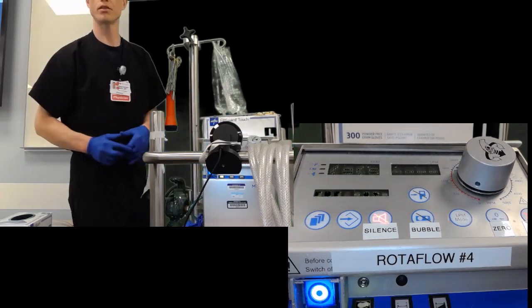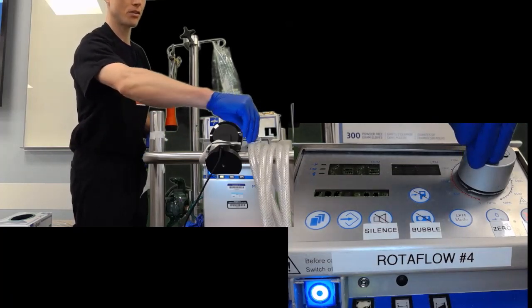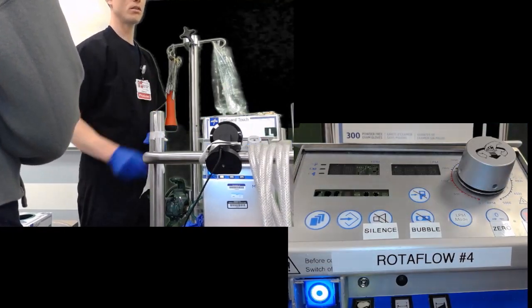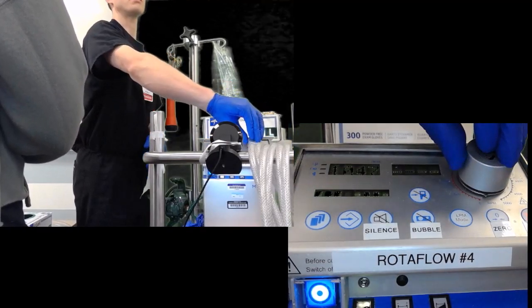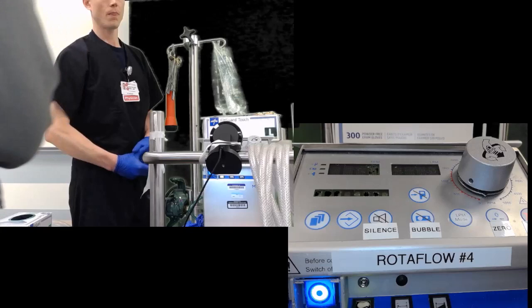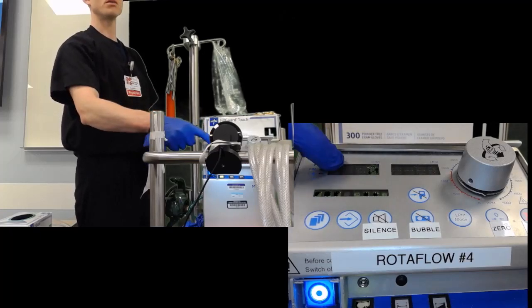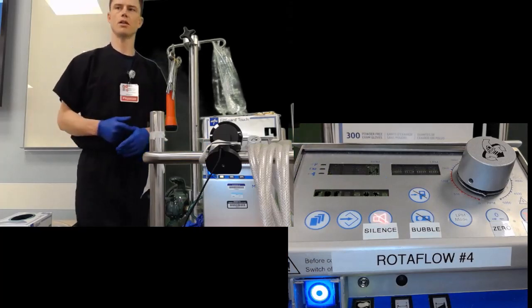But the next thing you have to do, much like your high school locker, is turn this back to 0 first. Okay, so now you see that it said 0. What I mean by that is if it was sitting here and you're not seeing anything, you have to turn it back to 0. So you push in, turn it back to 0 until you see 0 RPMs here. Now it's alarming because the flow is low. That's why it's beeping again. It's detecting, hey, I'm not seeing any flow, so I'm going to beep. And we're going to hit silence again. But now we can start turning up our RPMs.